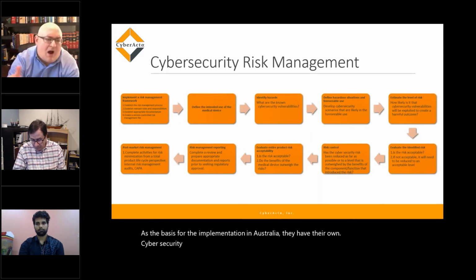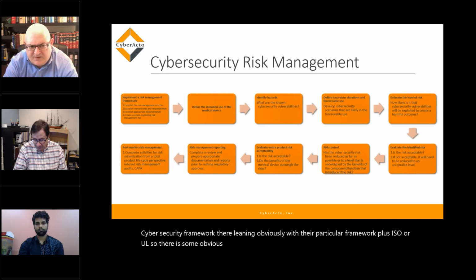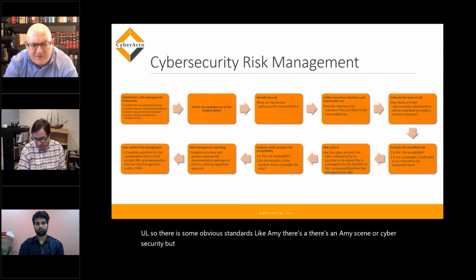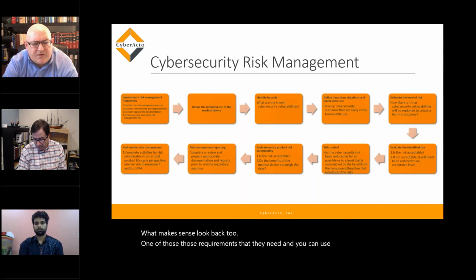They're leaning with their particular framework plus ISO or UL. There are other standards, like an AAMI cybersecurity standard, but really those are more to guide you through. Evaluate what makes sense, look back at the requirements that you need, and use whichever standard you deem more suitable for your organization.